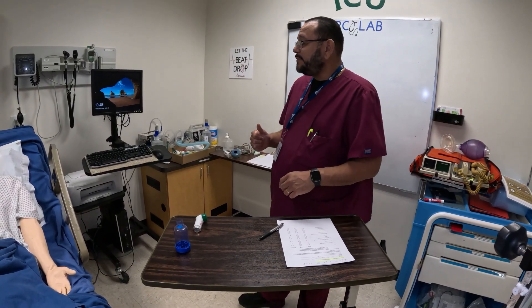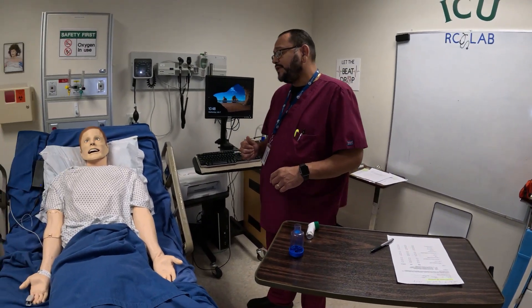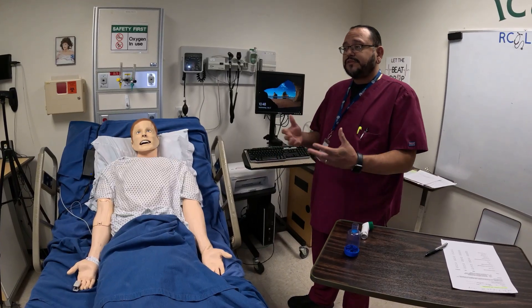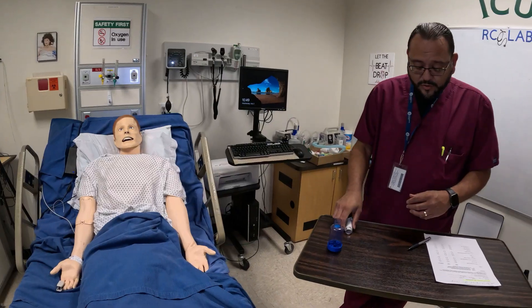I'm going to introduce myself. Mr. Smith, my name is Harvey. I'm with the respiratory department. Doctor ordered a breathing treatment for you — it's called an MDI. Have you ever had that before? If he says yes or no, explain everything to him in detail. I'm going to show you what I'm going to use.